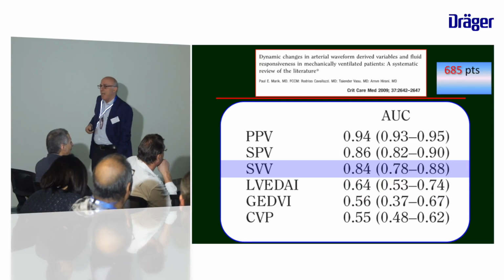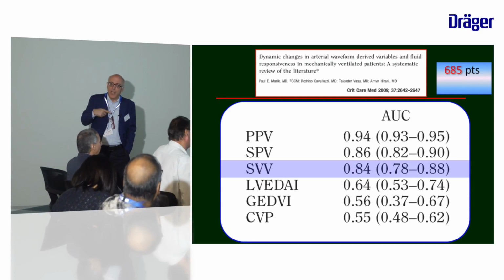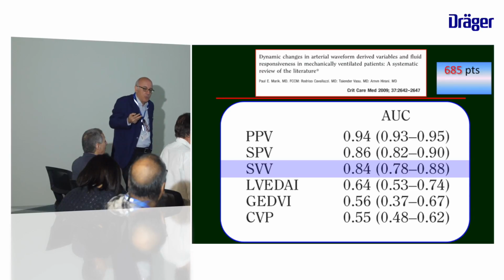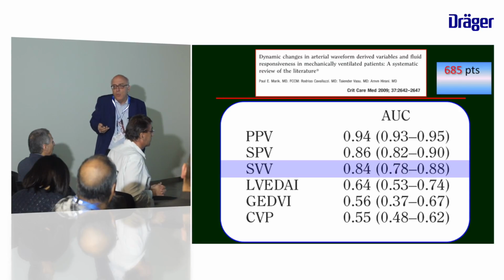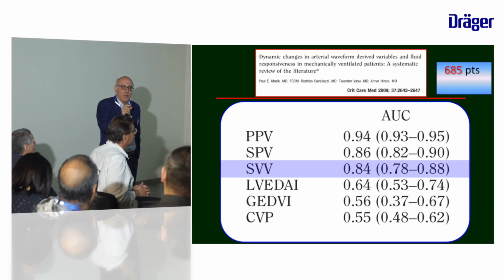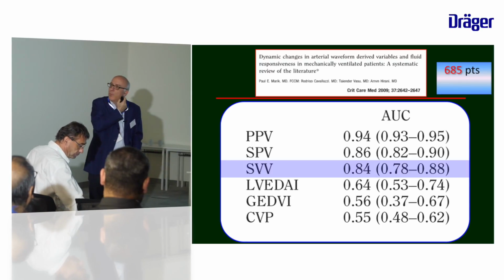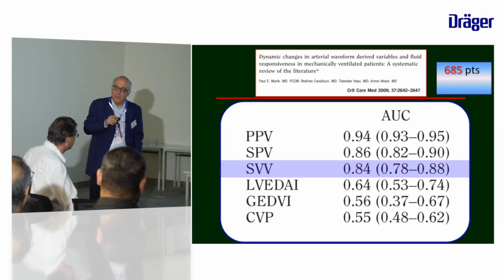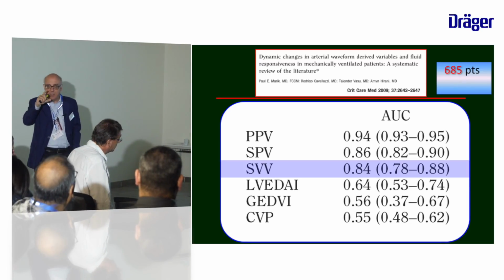The esophageal Doppler is another method. The question is that during operation you can use it. We don't use it frequently, but in the UK they use it more often. The question is in intensive care. In the post-operative period you can use it, but only when you are able to measure the diameter of the aorta to have a real value. Otherwise there is some sort of internal calculation according to the anatomy, which is not very precise as an absolute number. It is a possibility. We are not much used to using the small one.